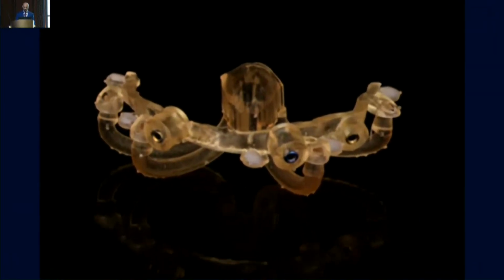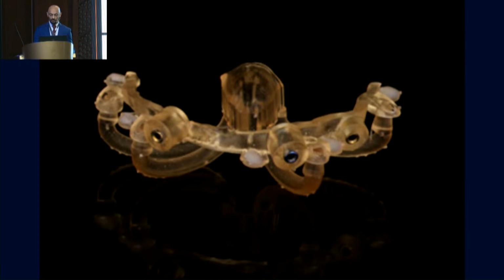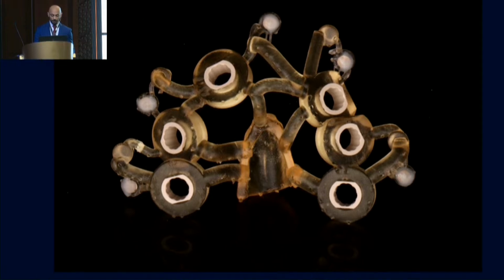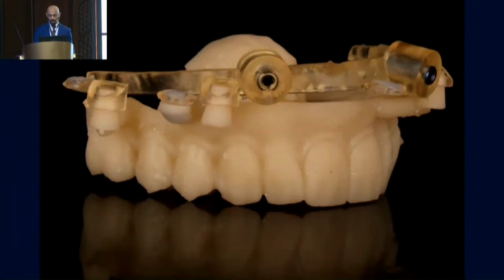So on the top left image here, we see the palatal jig that carries the first bone reduction guide to its correct orientation to be fixed in bone via fixation pins. Here, we see the stackable implant placement guide. And this is both guides stacked together magnetically. And lastly, the immediate load prosthesis 3D printed out of composite resin.